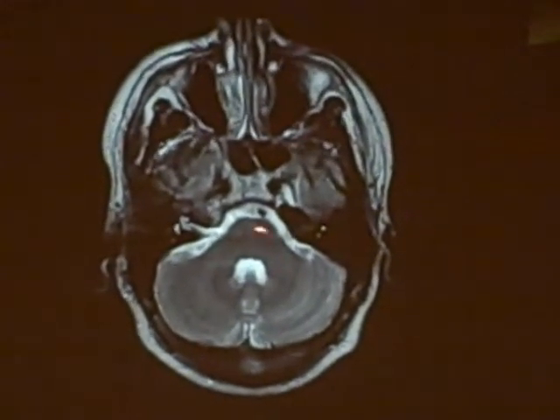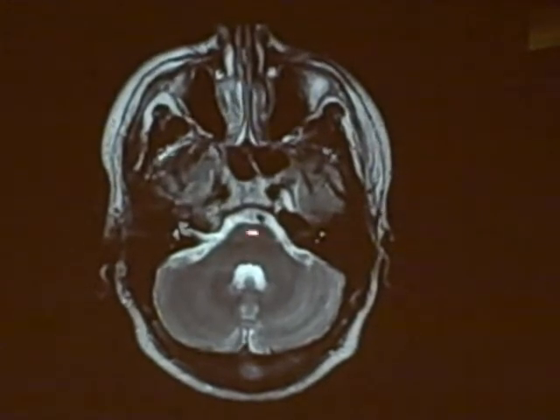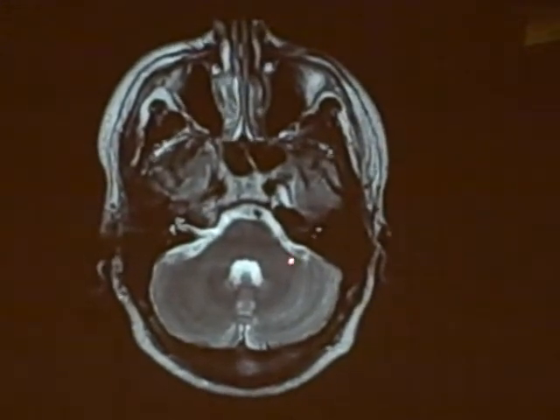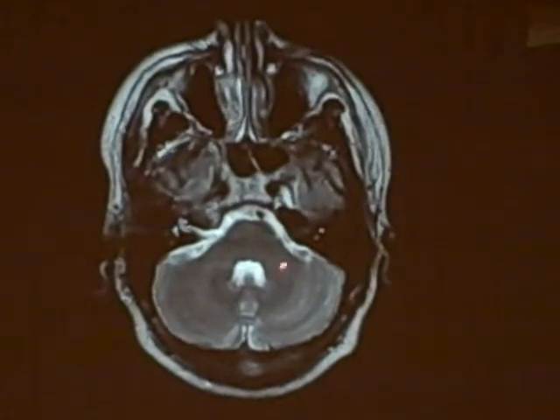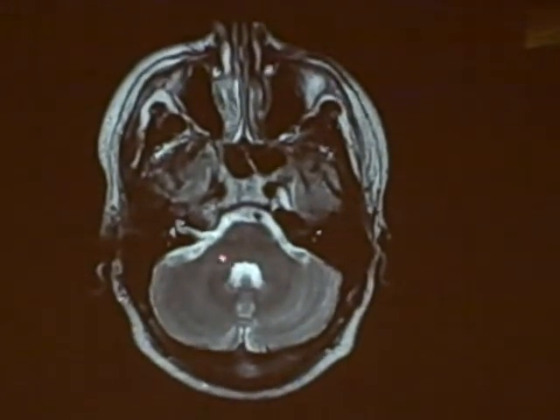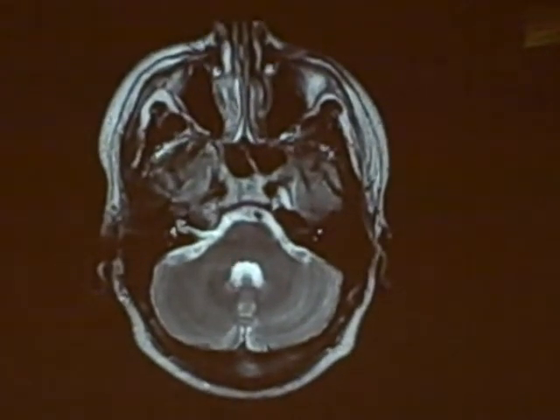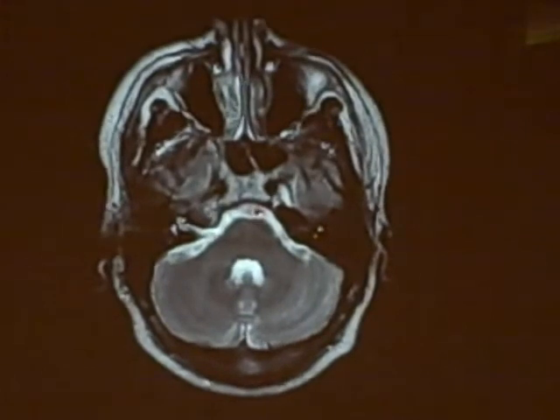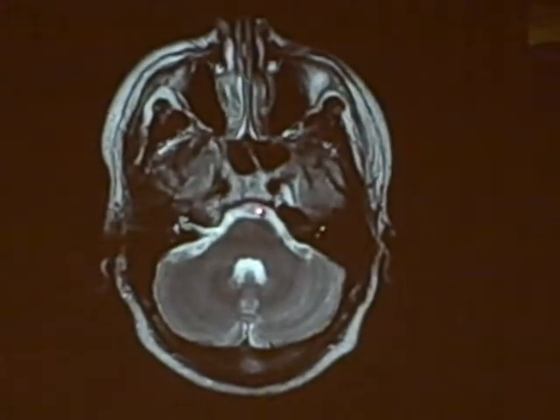We see the pons here, and the major connection between the pons and the cerebellum is the middle cerebellar peduncle. And the basilar artery is sitting right on top of the pons.